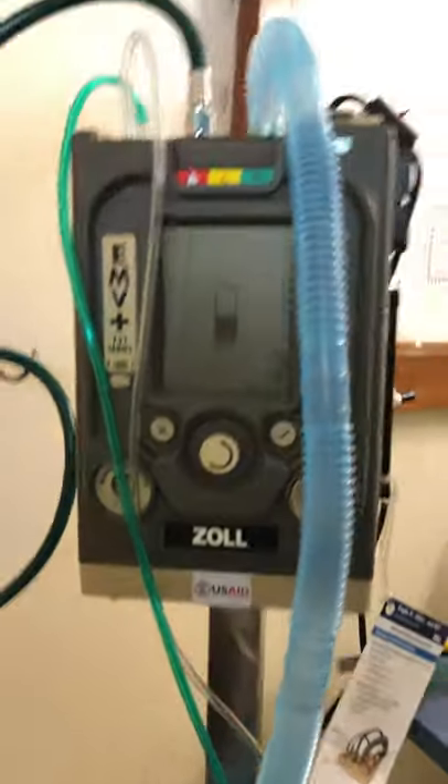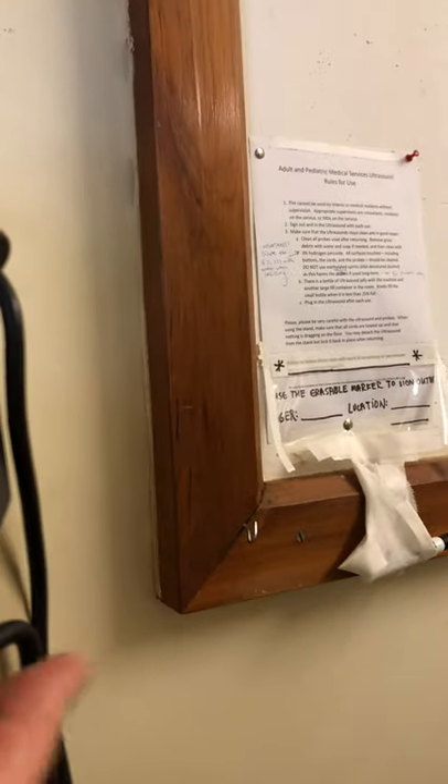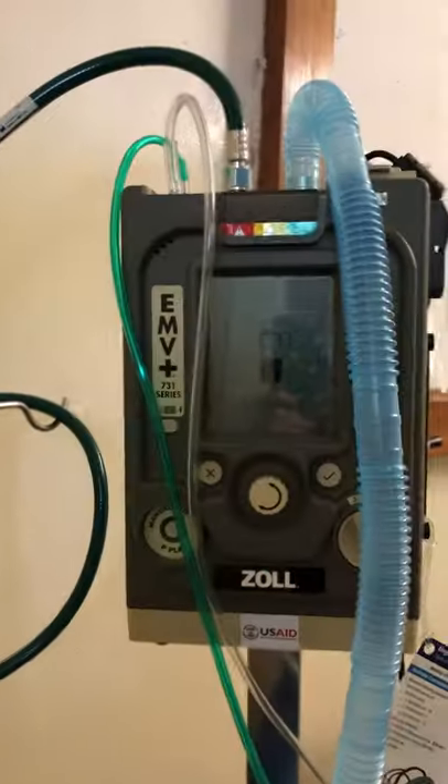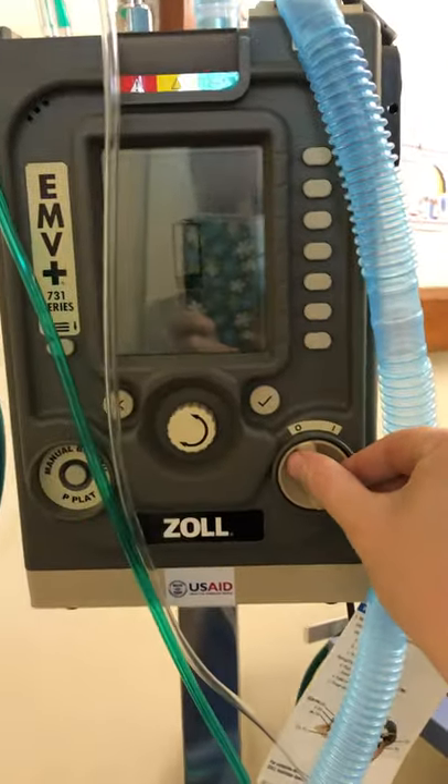There's no medical air connection because there's an internal air compressor. On the side of the machine, the machine will take air from the room and make its own medical air. Once you've got the tubings on, you can turn on the machine — that's this switch right here.